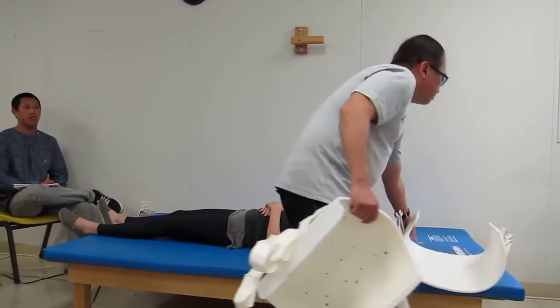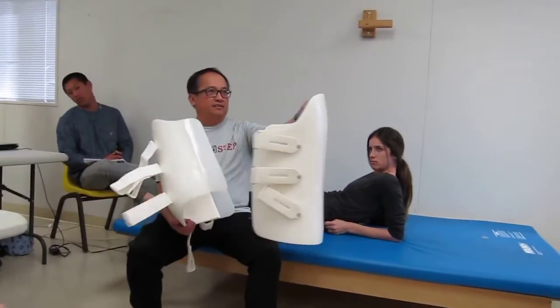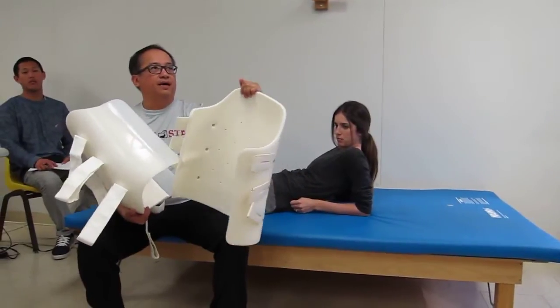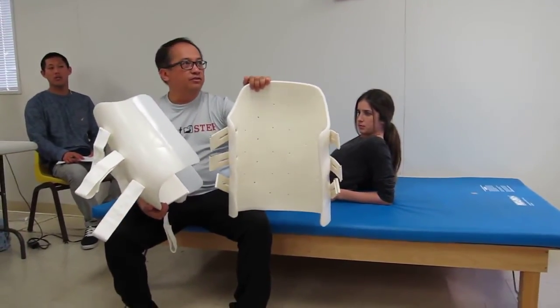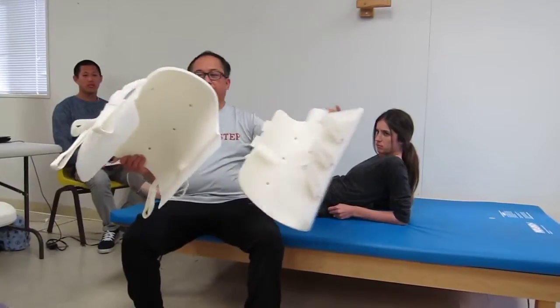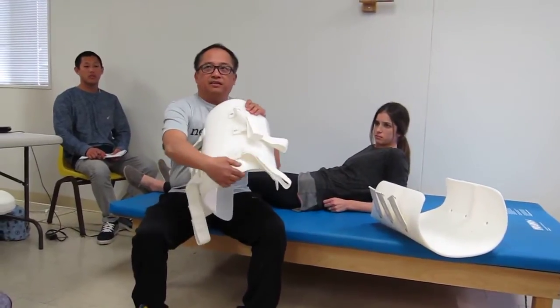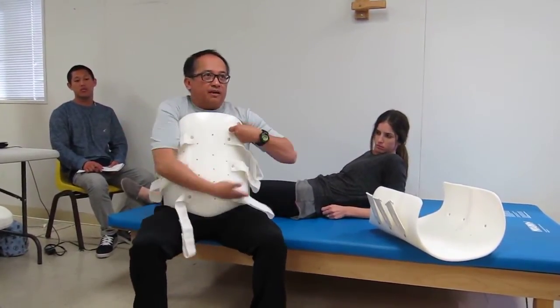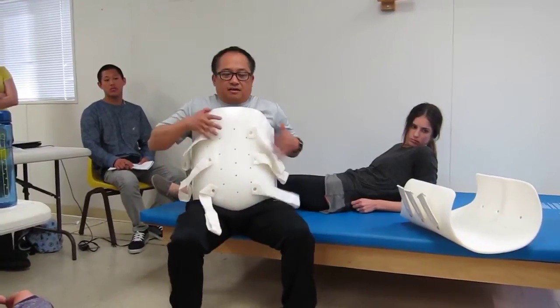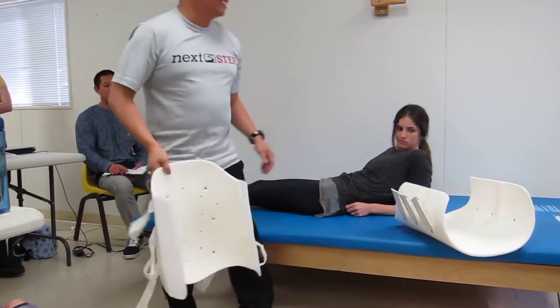When you look at this TLSO, this will always be the back. You can notice that, right? This higher piece is the top of the back. It corresponds with the cervical and thoracic area of the spine. And how do you know that this is the top versus the bottom? The bottom will be a little bit more curved because of where it positions itself here, in the perineal area, because this would not be good. Got it?